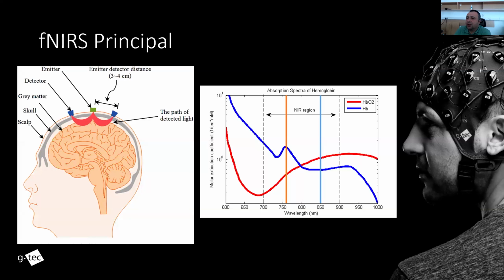So typically, the light emitter and detector are placed ipsilaterally, meaning that each emitter detector pair are on the same side on the subject skull. So recorded measurements are due to backscattered or reflected light following elliptical pathways. fNIRS is most sensitive to hemodynamic changes, which occur nearest to the scalp, and these superficial artifacts are often addressed using additional light detectors located closer to the light source, the so-called short separation detectors that I will present to you a bit later.